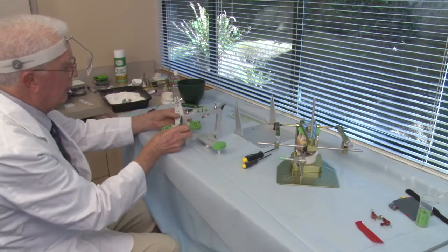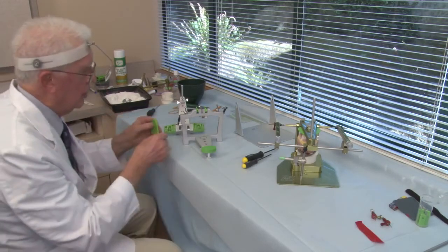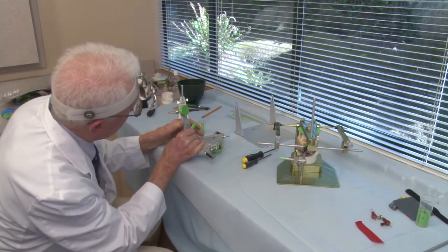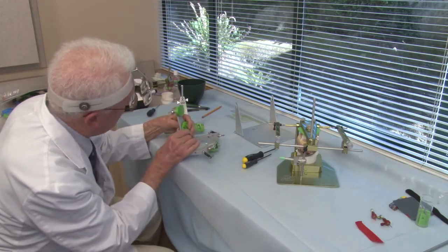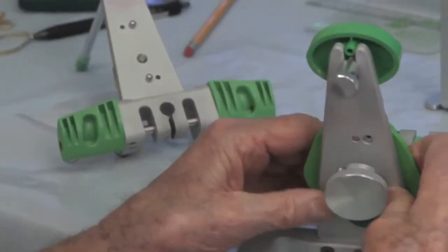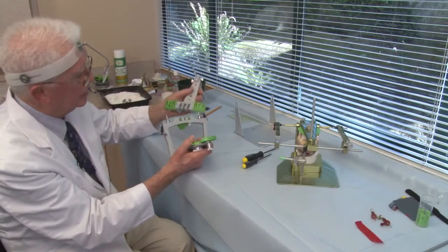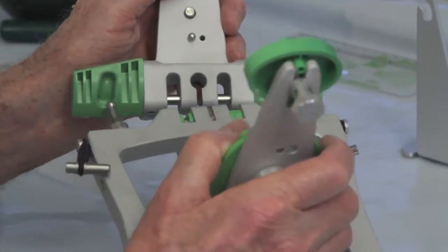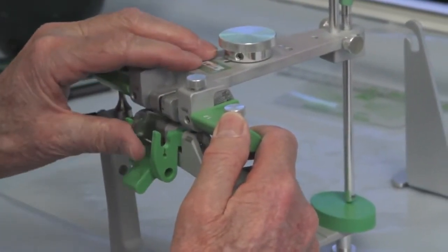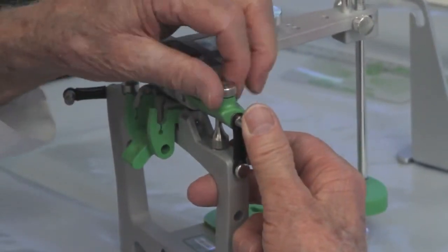And I will put a mounting plate on the lower. Remember, you put the mounting plate on with your hand, and let the screw just hold it. Now to put it back together, seat your condyles first in the fossa box. And then close it. Put your centric lock on. Attach your side shift activators.